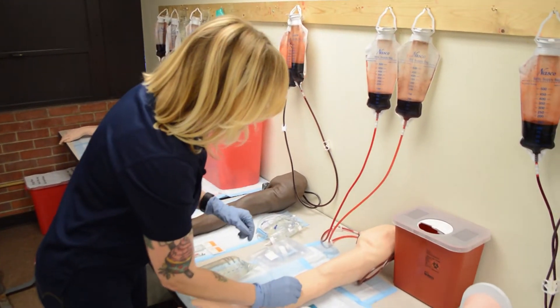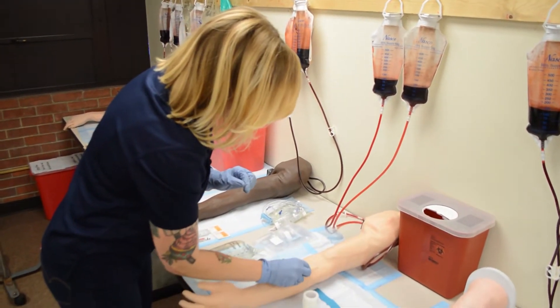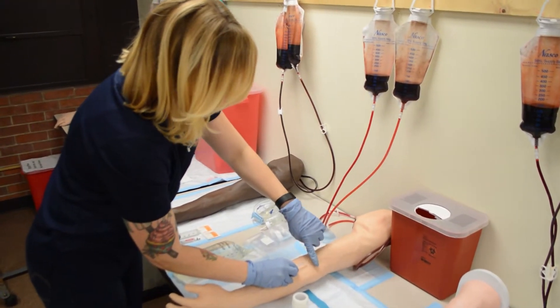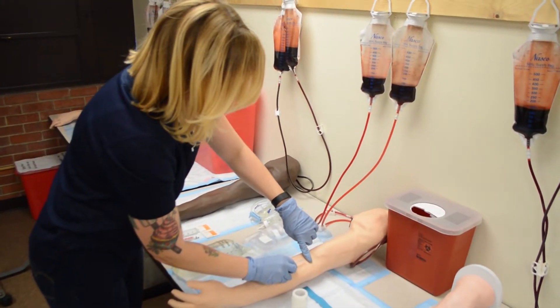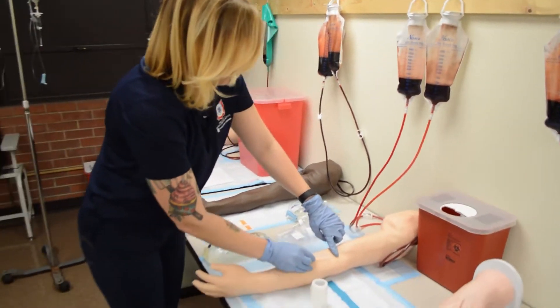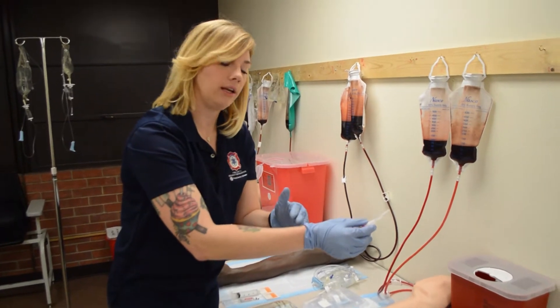But if I'm having trouble — if I have my IV catheter here and I've lost my vein — I can use this opposite hand to go again and start feeling, and at that time I can redirect my needle using my arm as my needle. It's not just your hand; you are an extension of that needle.